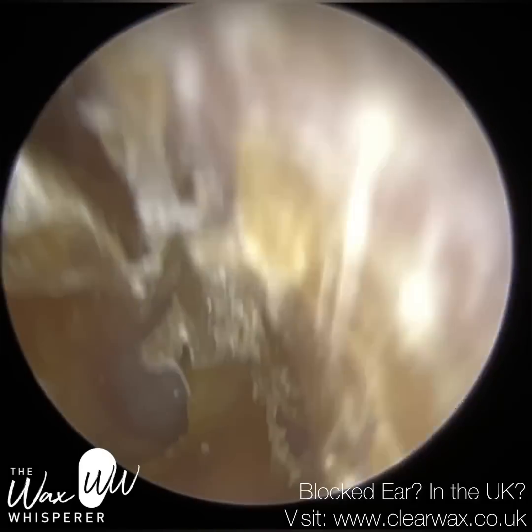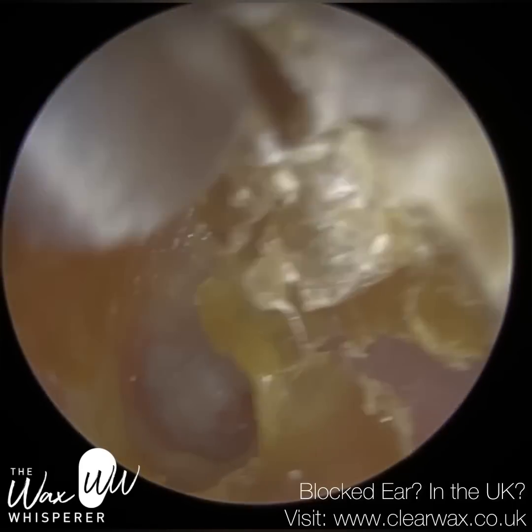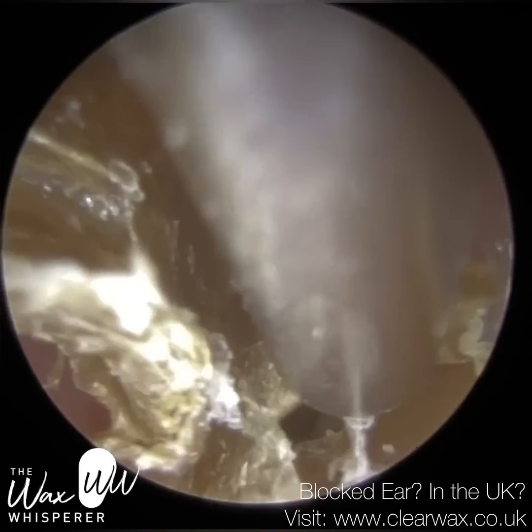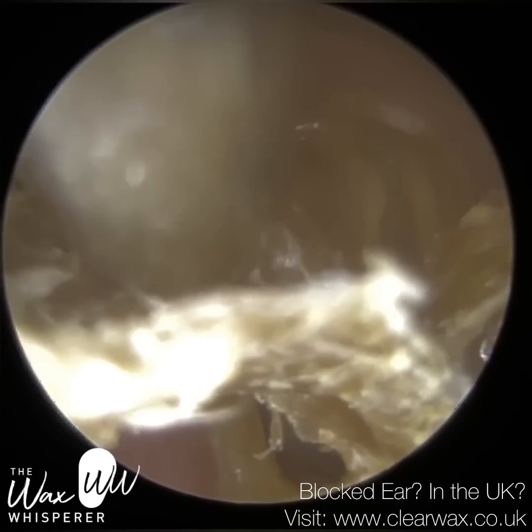It doesn't mean that you can just go in the ear and start gliding around, because if you do it in the wrong regions and you don't get the angulation right, it is going to cause discomfort to the patient, particularly when you're encroaching on the inner 2/3 of the ear canal. So you're still going to be very careful.